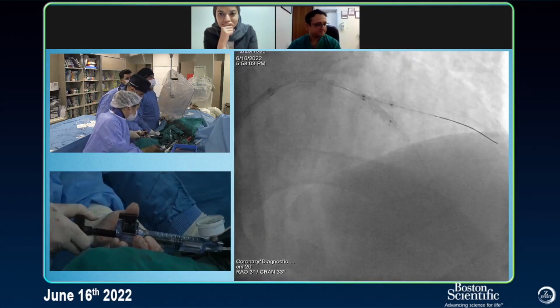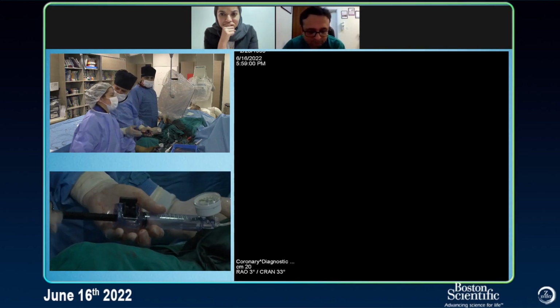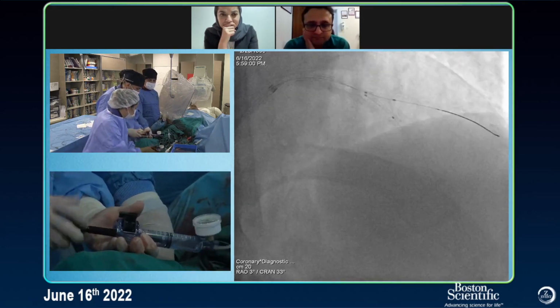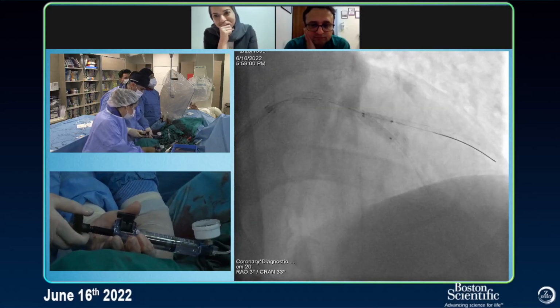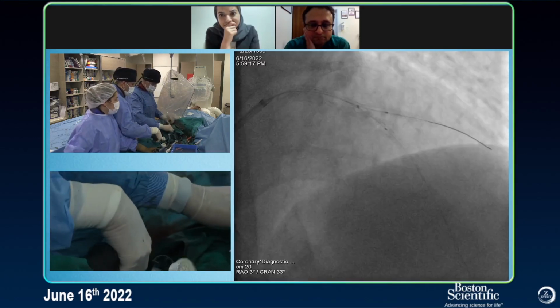6, 8, 10, 12, bekle. 2, 4. Ben yanlış şey düşündüm. Direkt. Well, diagonal. Okay. They didn't do the simultaneous kissing, so I asked them again. 4, 6, 8, 10, 12. Down. Okay, let's see what we have here.